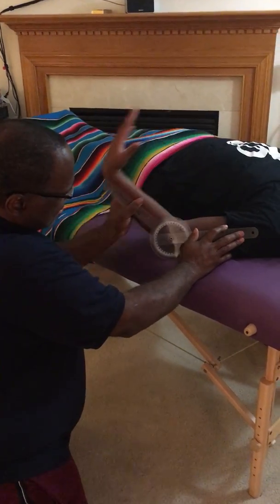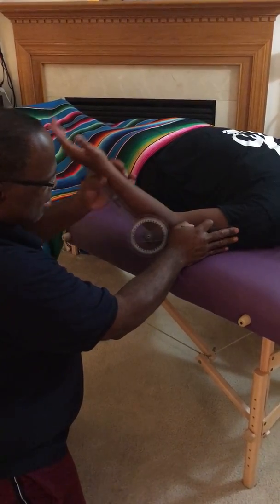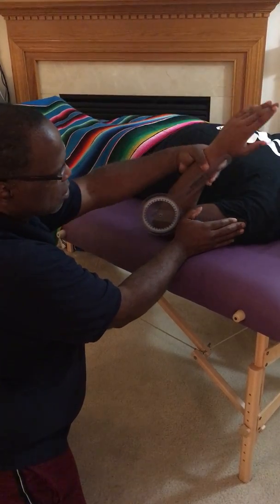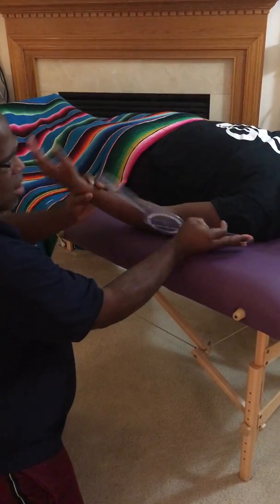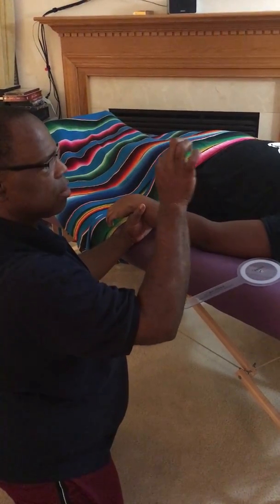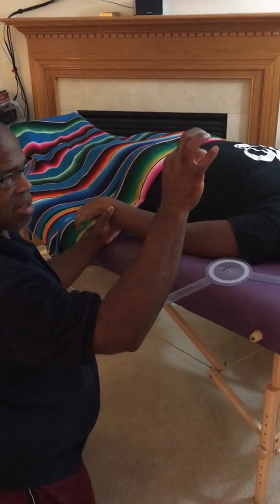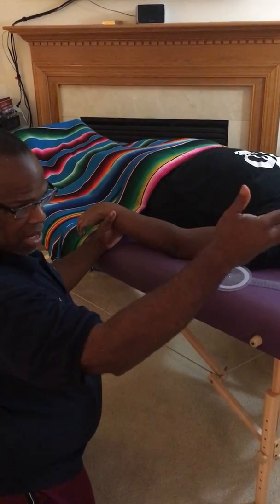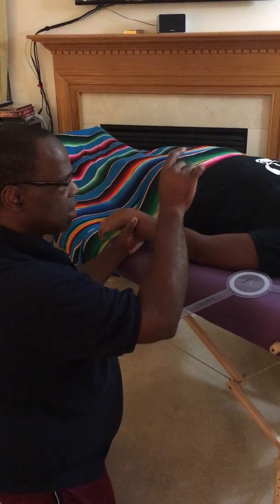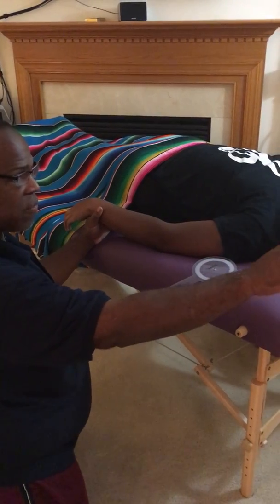So that is her elbow flexion. 165 degrees. So it goes from 40 degrees to 165 degrees. So the number would be written as 40 to 165 degrees. Active or passive, depending on how we ask them to do that or push for us. But 40 to 165 degrees. That will be the number for flexion.